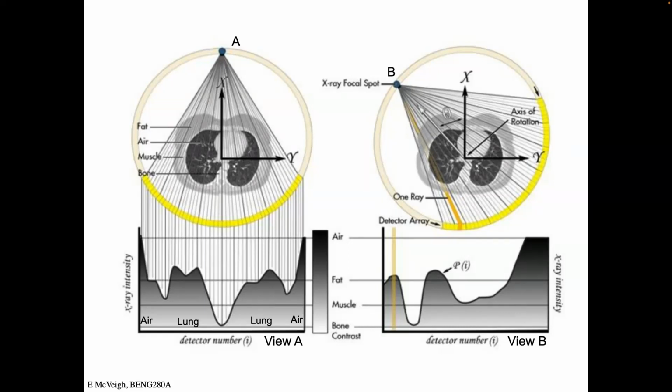So the fundamentals of how CT imaging works and what signals we're going to take in order to take a really good picture, we'll describe in the next few slides. And so here's a point source of X-rays, ideally. Here's our detector. And here's the patient casting a shadow on the detector, okay? If I look along one line here, I know what that line is because I know where my detector rotation angle is, and I know where I am on the detector element. So here, I know I'm looking straight through the patient along this line.